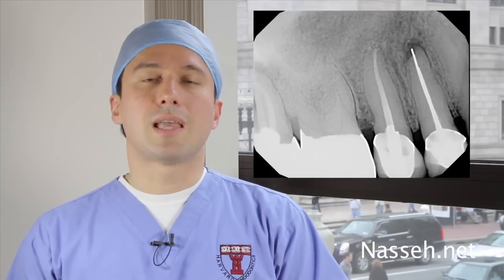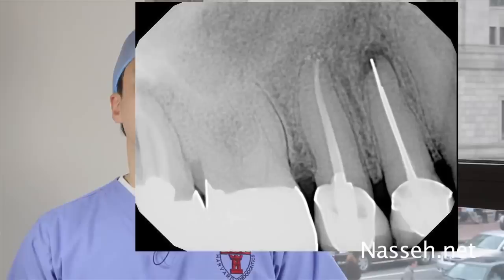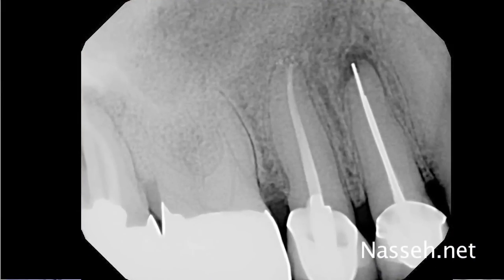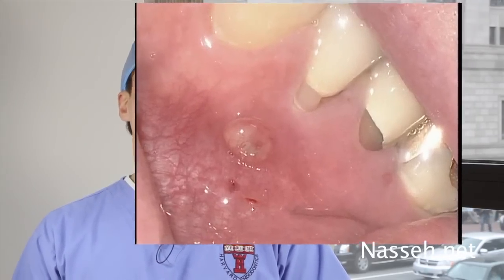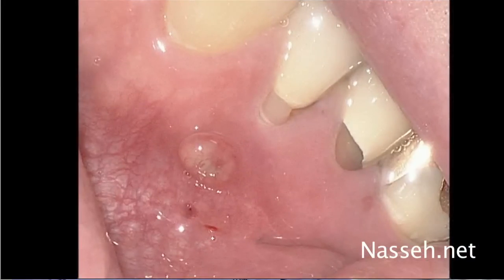Today's case is that of a patient with a silver point treated tooth number five under an old crown. The patient does not recall when the root canal or the crown were done. His chief complaint is occasional pain and swelling in this area, with the presence of a gumboil adjacent to the right premolar tooth. Clinical examination shows a sinus tract on the buccal aspect of tooth number five that traces the periapical lesion around that tooth.